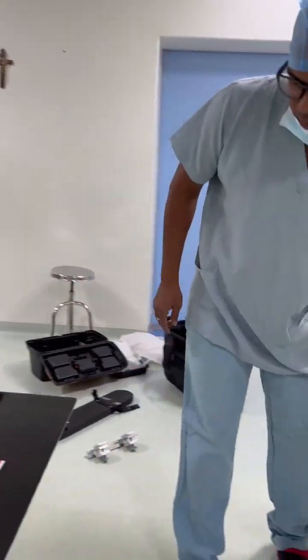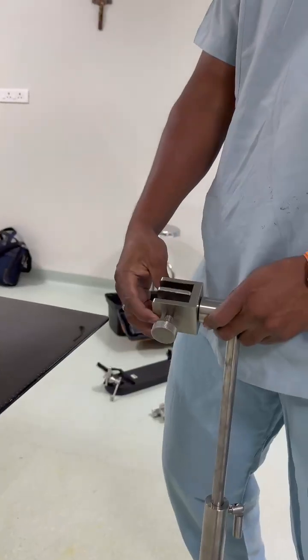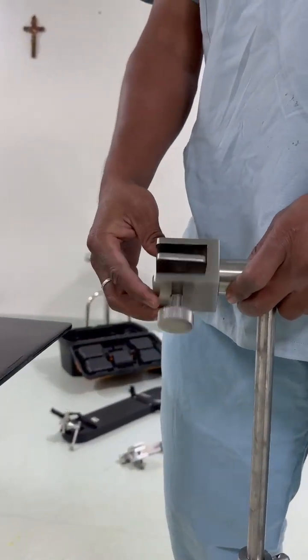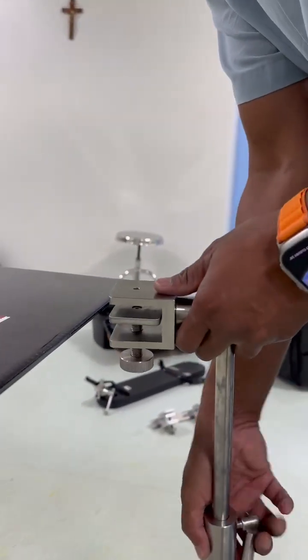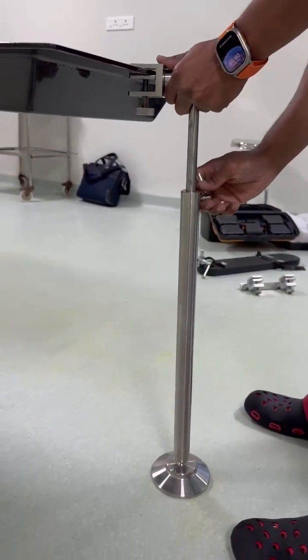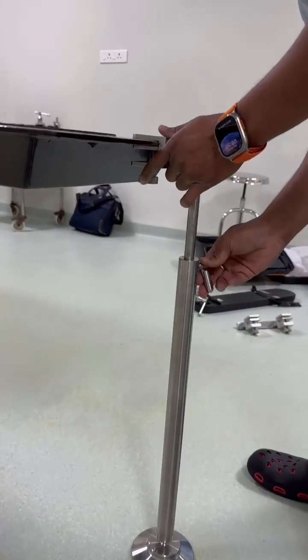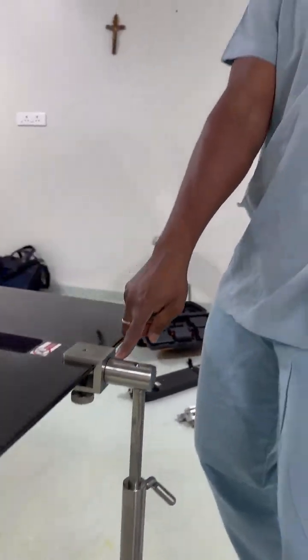We also have a floor support. The floor support itself has a height adjustment, and we also have a tilting option. This tilting option allows you to tilt the table without removing your floor support. Sometimes the surgeon wants to tilt the patient, so you can tilt.